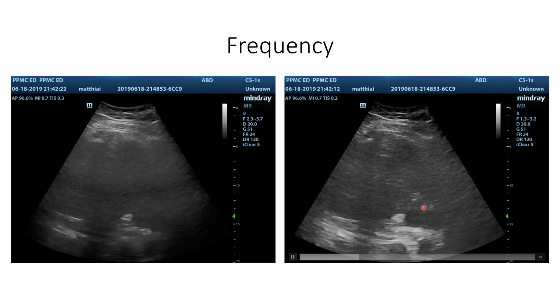First of all, what do we see here? We see a not so great image on screen left, and we see a really awesome looking image on screen right. So far, the thing I know about harmonics is that they're awesome and they make the image look totally awesome. And specifically, I see a liver where the resolution of the speckle, the little white, black, and gray, is much higher than this smushy, smeary looking image with no harmonics. I think I'm going to have a much easier time making a call about the quality of this liver parenchyma. Is it heterogeneous or is it nice and appropriately smooth?